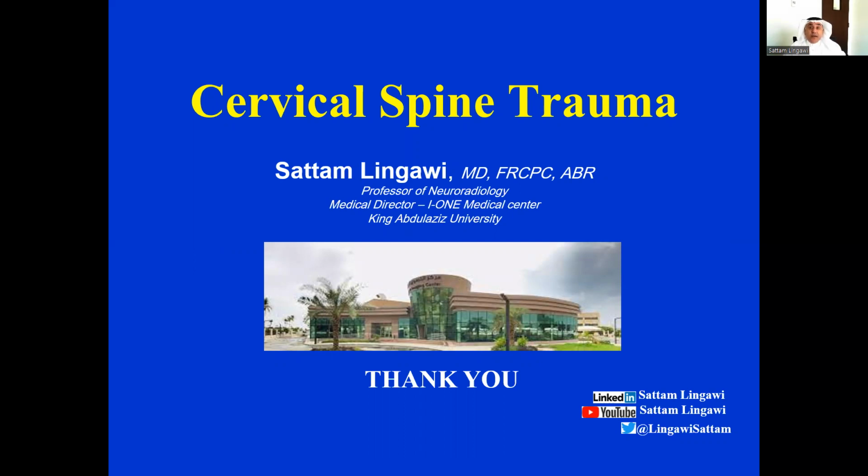should be extensively studied, particularly by junior residents who are covering emergency on-calls, as well as by the trauma surgeons and the emergency staff, as missing a cervical spine injury is detrimental to patients' survival and outcome, and could have catastrophic results among those who survive with missed injuries and result in a long-term neurological deficit.